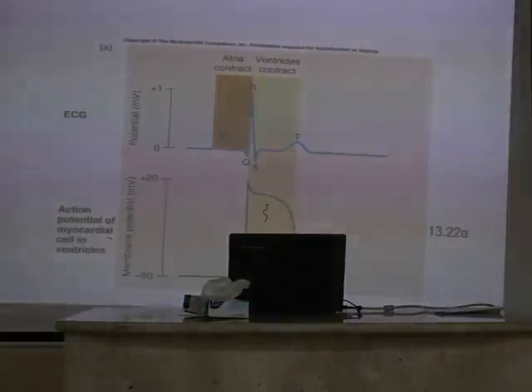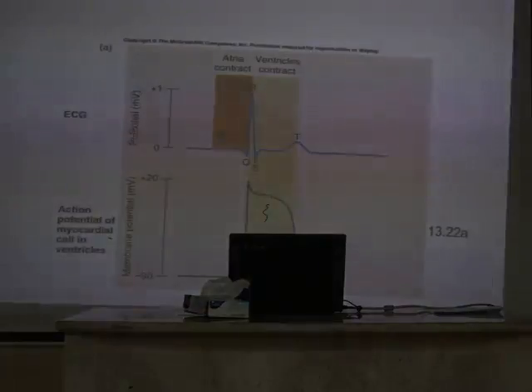Okay, so now you have got two names of this segment. The first is, if Q is visible, PQ. And if Q is not there? PR. The more famous name is PR segment. So don't get confused. PQ or PR, same thing. If Q is visible, you call it PQ. If not, you call it PR.